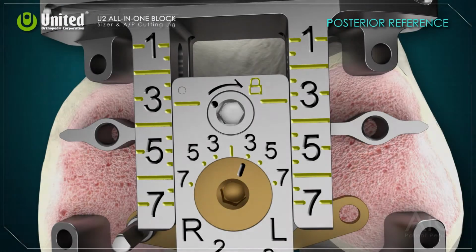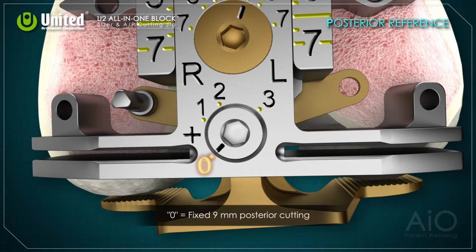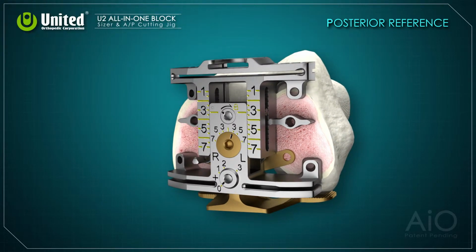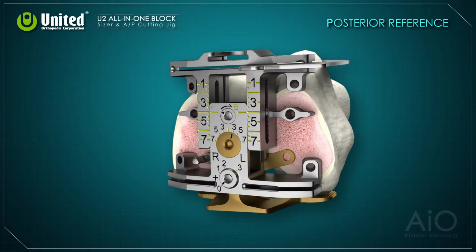While sizing the femur with a posterior referencing system, make sure that the bottom knob indicates 0, which means the 9 mm standard posterior thickness in the prosthesis. Remove the stylus. Then use the lower point gauge to avoid the possibility of anterior notching. Determine the proper size.